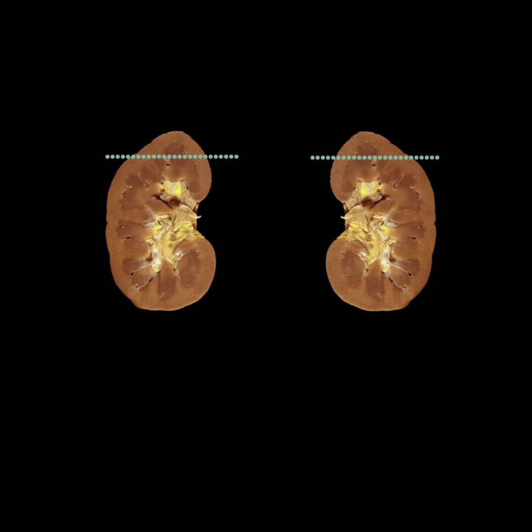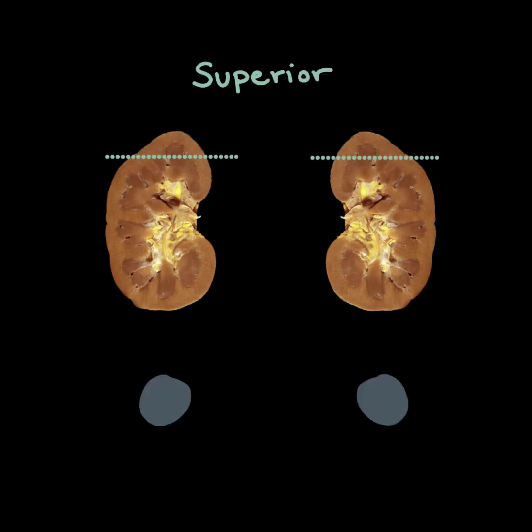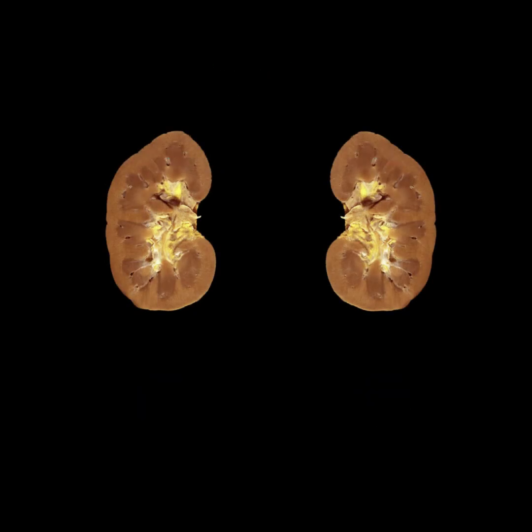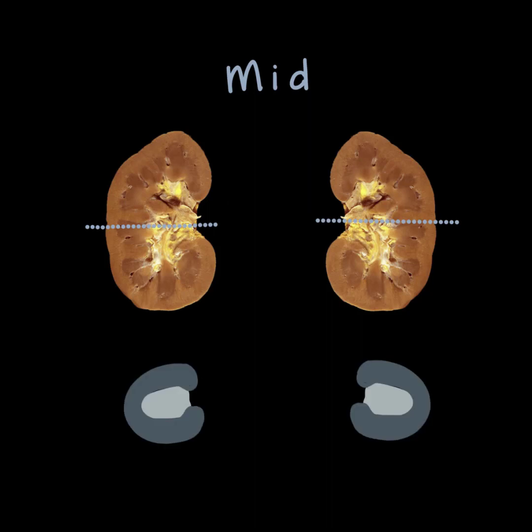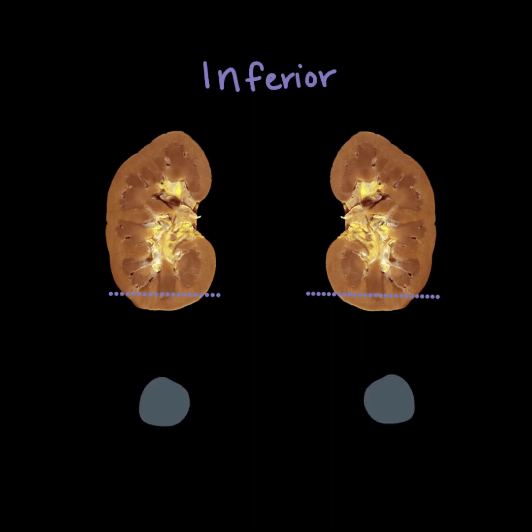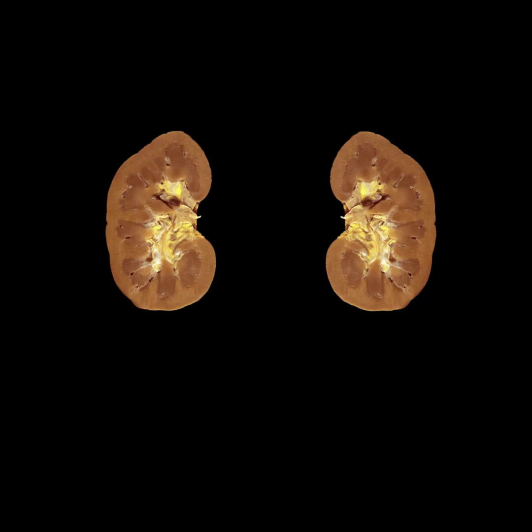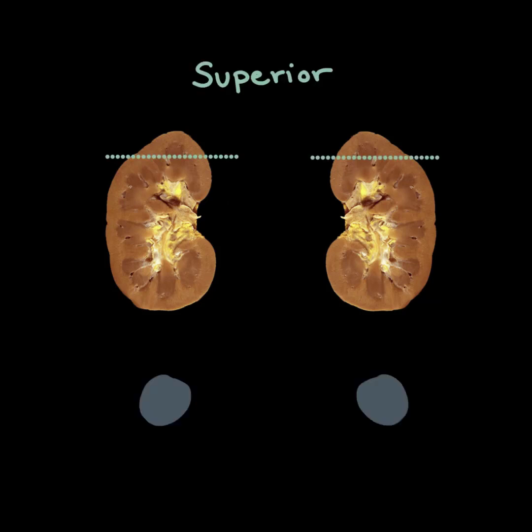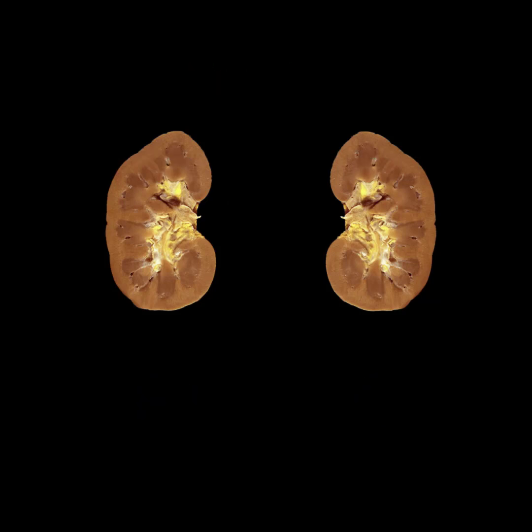In transverse, try to keep your kidney as round as possible. The superior pole has either the liver or spleen nearby, but not always, and you should also see little to no sinus in the superior pole. However, you do not want to stop at a portion that does not clearly look like renal parenchyma.